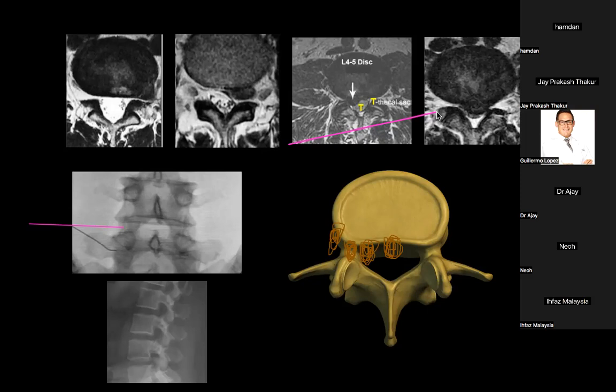And the second advantage is that you are anesthetizing the entire segment from the annulus to the skin. You anesthetize with that, and you get a direction sense also. And then you go with your 18 gauge introducer needle. Okay, got this point? This is clear. It will all depend on the patient to patient and also from level to level.